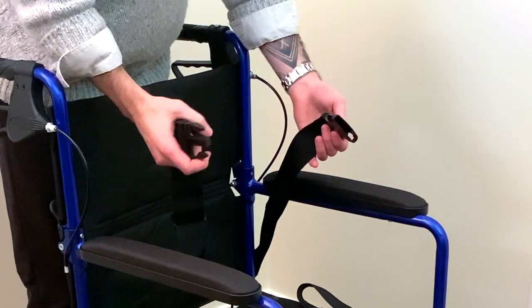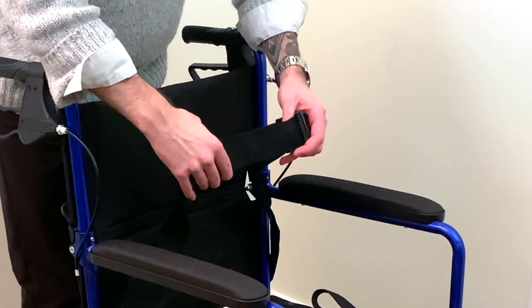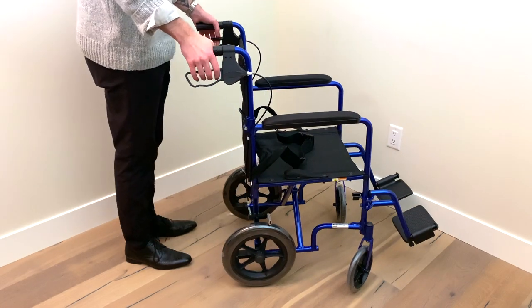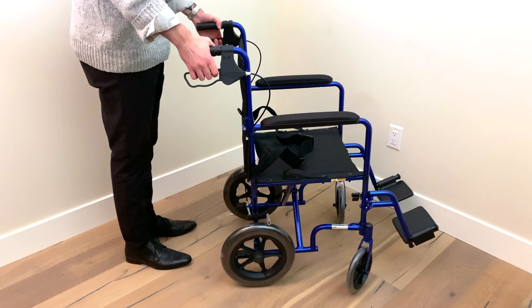This transport chair also comes with an adjustable safety belt that should always be used when the chair is in motion. In addition to this, it also comes with easy-to-use locking handbrakes. Simply push them down to lock the rear wheels. To unlock them, just pull them back up.